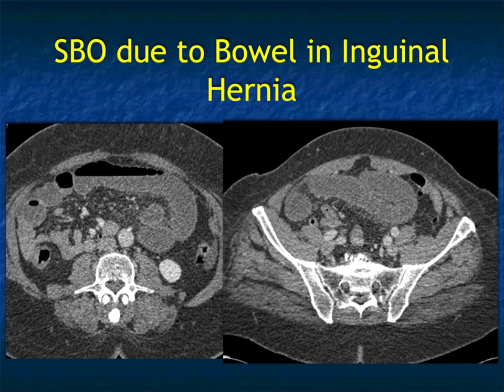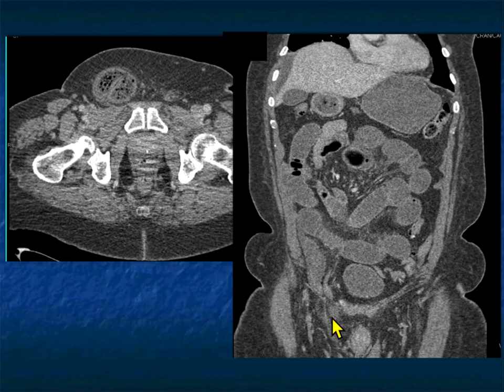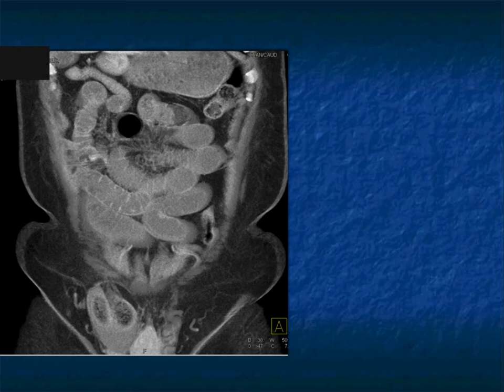Here's a good example: the patient has dilated small bowel loops and the question is why — maybe adhesions, maybe a mass. But as you scan down, particularly in the coronal view, you recognize the transition point in the right lower quadrant, and then you see that's a loop of bowel extending into an inguinal hernia, very nicely shown on the 3D views.